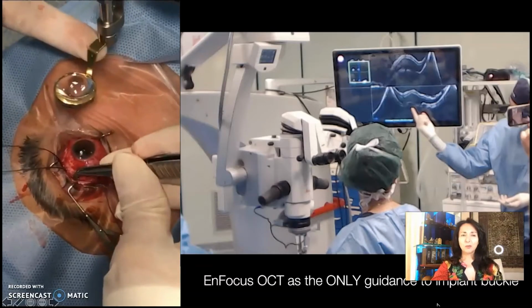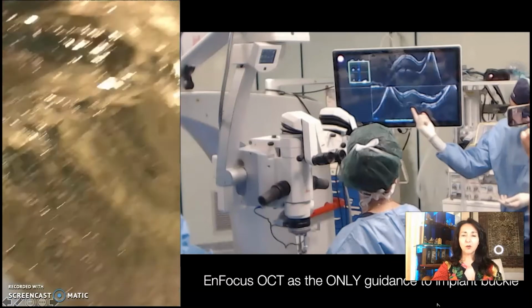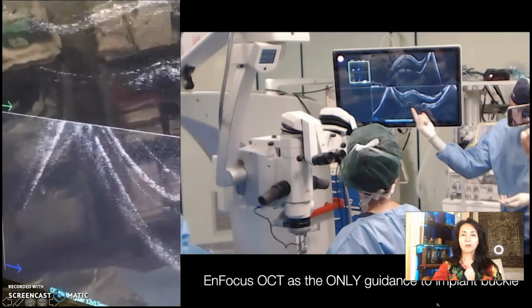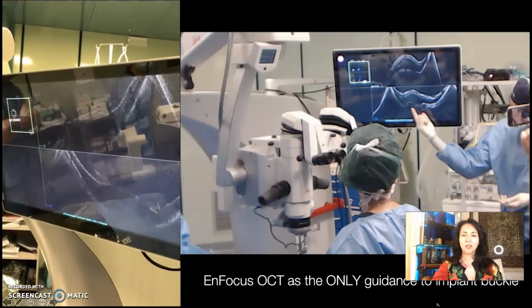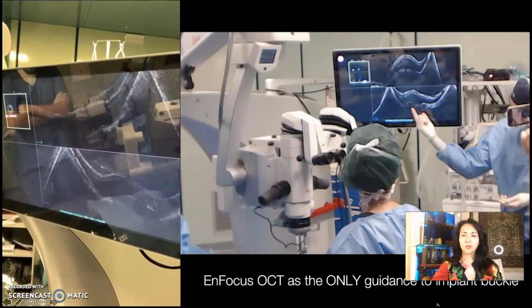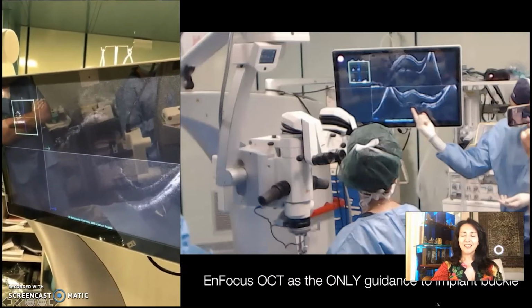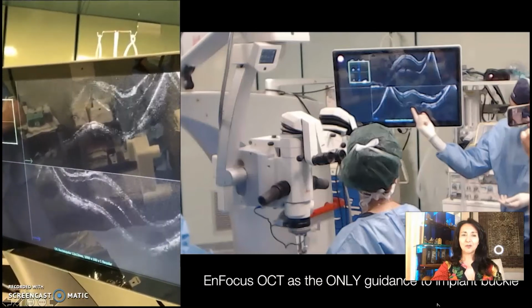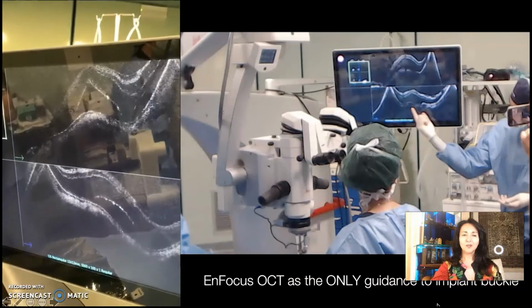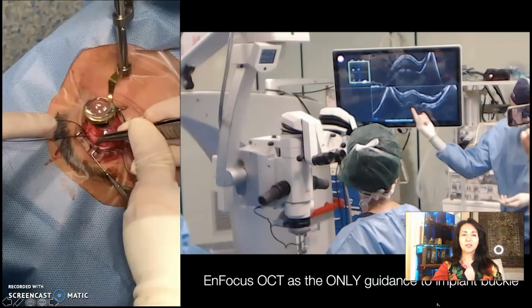This is an extreme case. I am implanting a macular buckle only with the guidance of intraoperative OCT, without endoillumination at all. This is only buckle with no vitrectomy. So you see my coworker pointing at the location of the buckle, which is exactly under the fovea, and you see the images live through the intraoperative OCT.